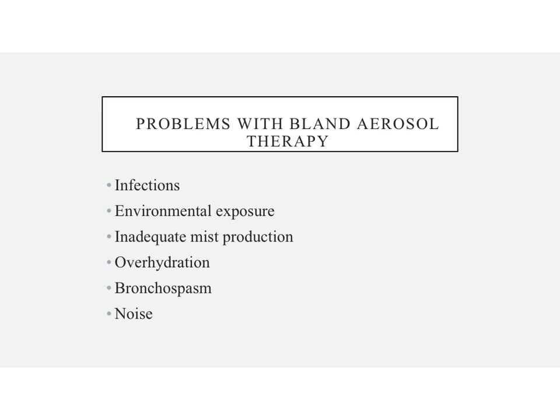So, some problems we might run into with bland aerosol therapy: infections. We have those larger particles where bacteria likes to grow being produced. So, infection is really a big enemy of healthcare in general. So, we want to try and prevent this whenever possible. So, we want to adhere to our hospital's protocols, the CDC guidelines, and JCO guidelines to prevent infections.